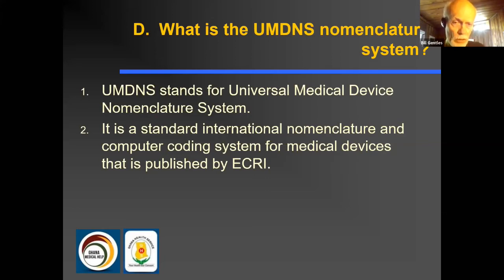And so we're recommending that this UMDNS nomenclature system be adopted throughout Ghana to standardize the way you describe your inventory. And in the next few slides, I'll illustrate why that's going to be important as we move forward with the inventory.